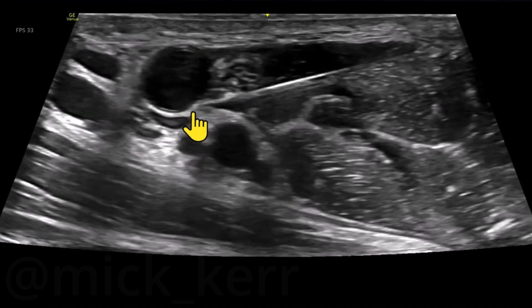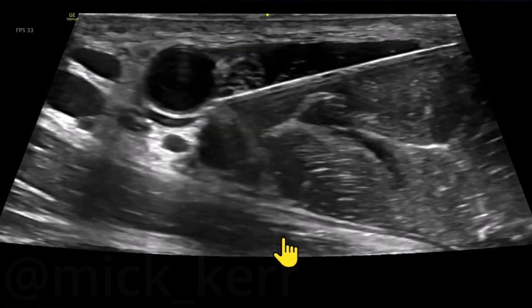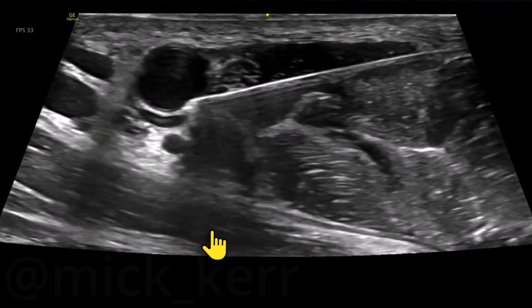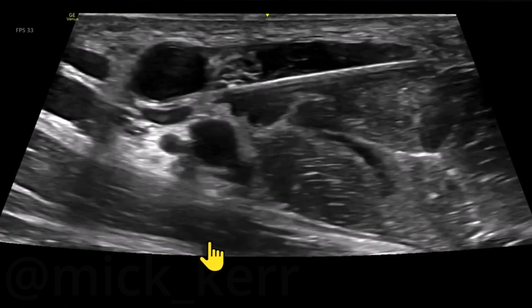Gentle, gentle — and we can see some tenting, some rolling, that's okay. A little bit of gentle pressure and we'll get a release in a second. Tiny release there, so we'll test together with some local, and a little pop.